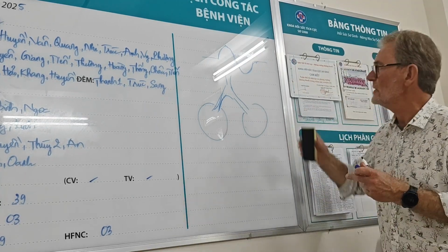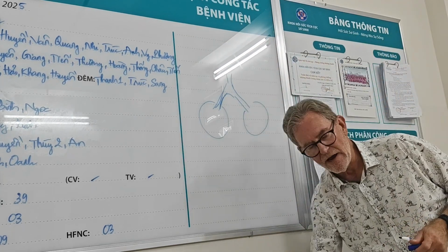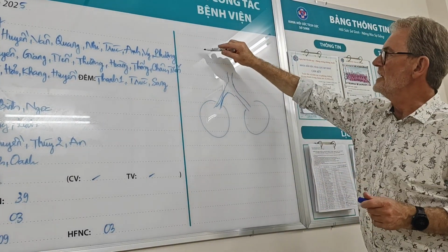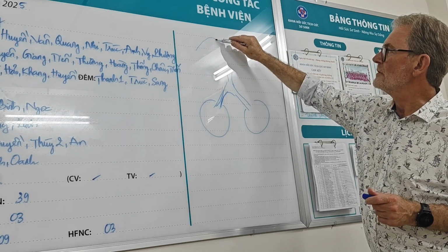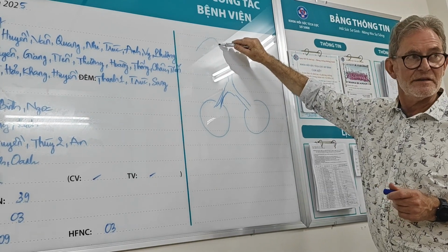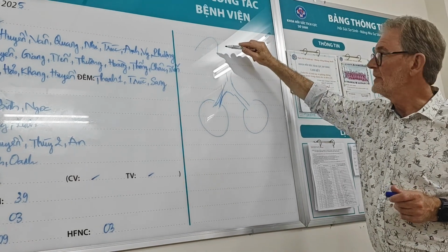Now what happens if you've got a lung with high airways resistance and you use a short inspiratory time? You see the flow go like that, but it doesn't come back to zero. It just suddenly drops.